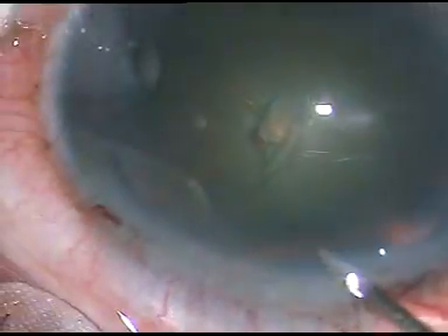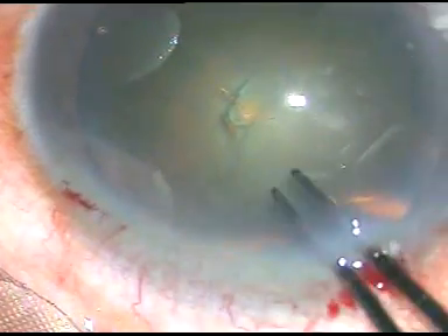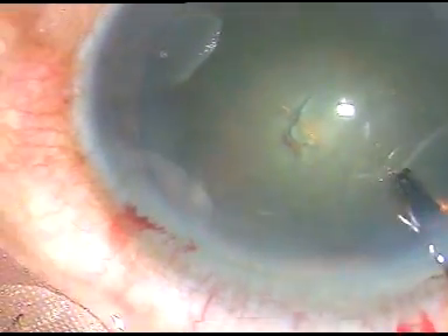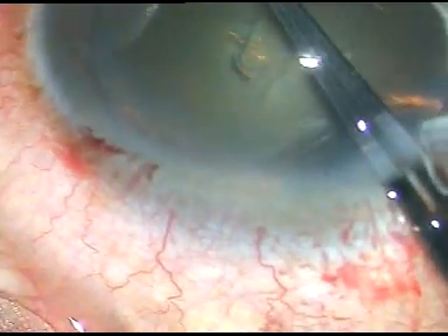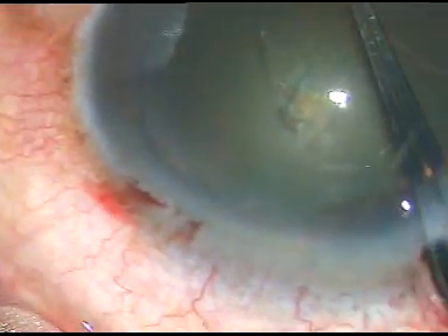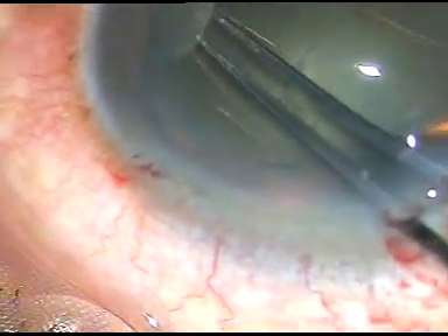This is the cystotome. The anterior capsule is being incised and the flap has been raised. I use a Utrata forceps to hold this flap. I am going anti-clockwise and doing a continuous curvilinear capsulorrhexis. That is it — it is done.